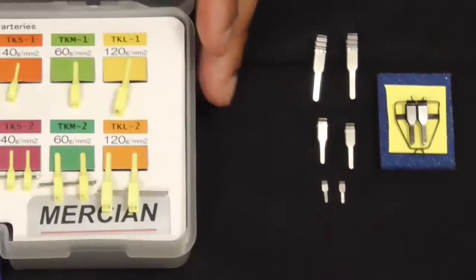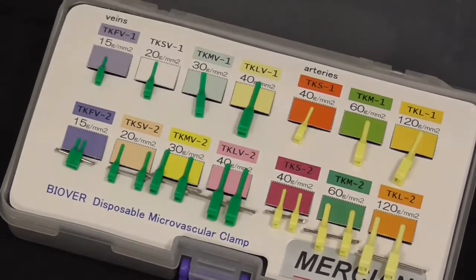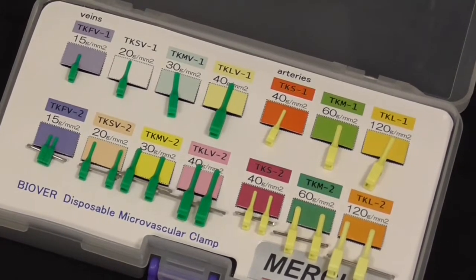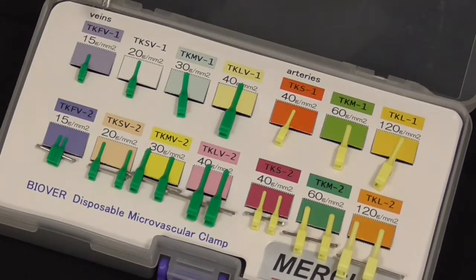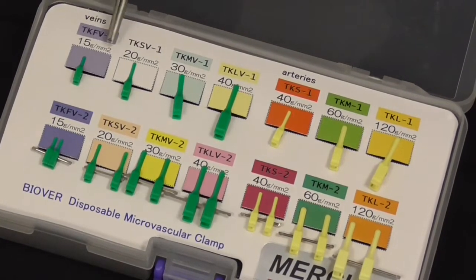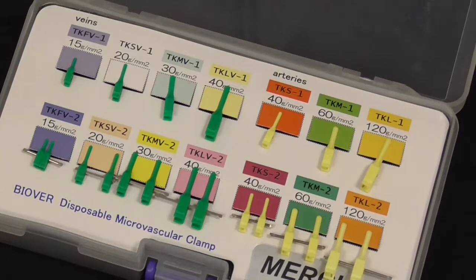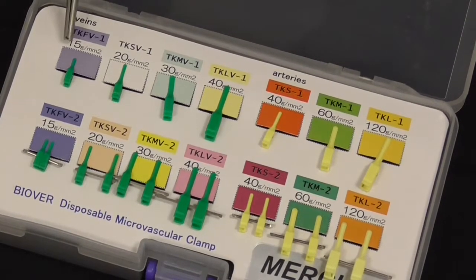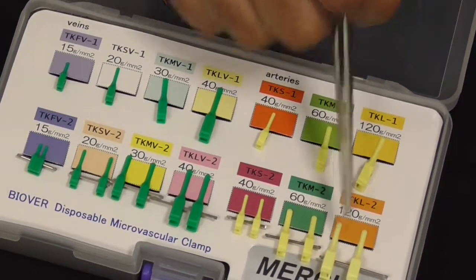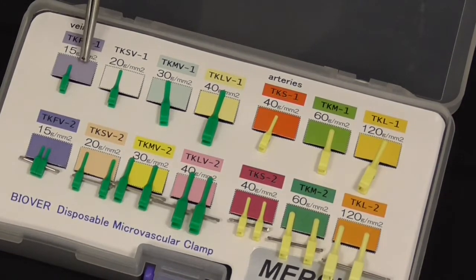There are new clamps that have been brought out—these are ones like Mercian, which are all disposable microvascular clamps. They're single clamps and double clamps. The interesting thing is they all have these little numbers on them: 15 grams, 120 grams. These refer to the clamp closing pressure—the force applied by the clamp in grams per millimeter squared over the maximum width of the vessel.